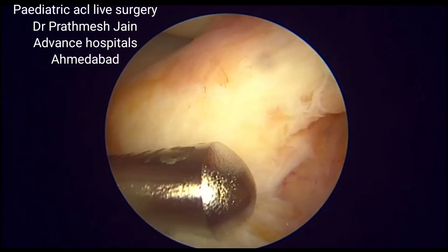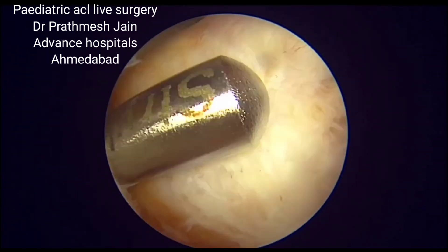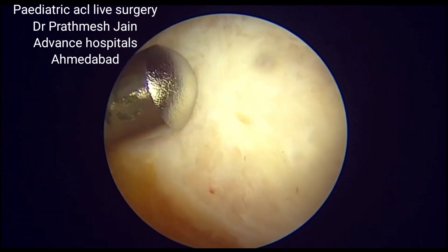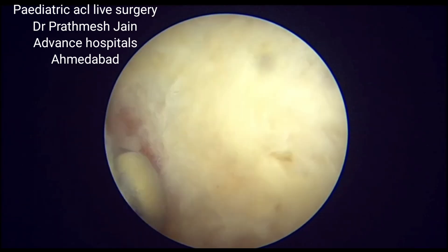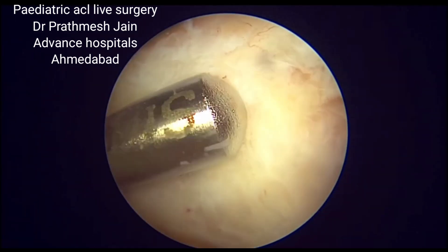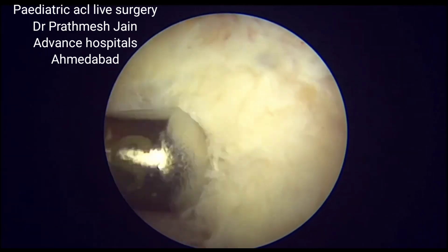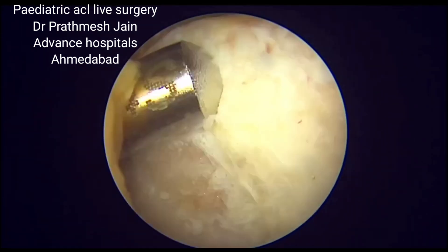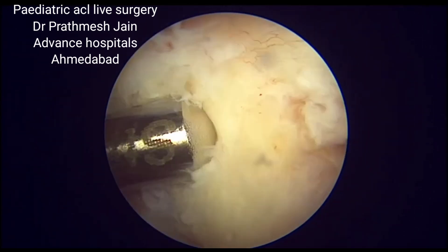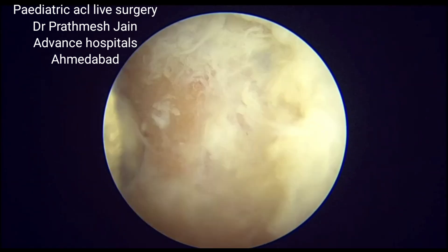We go underneath and make a portal beneath the intermeniscal ligament, cleaning the area just anterior to the ACL footprint. I usually use a Stryker curved shaver blade, which works very well. I do a little aggressive shaving in that area to expose the raw bone, which will increase the healing of the ligament and the graft at that site.